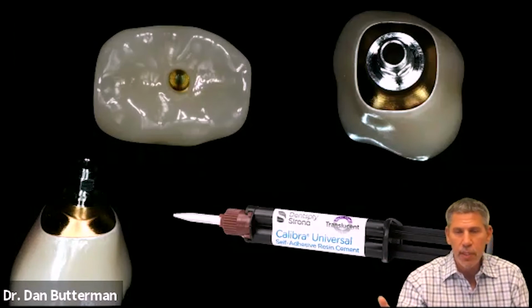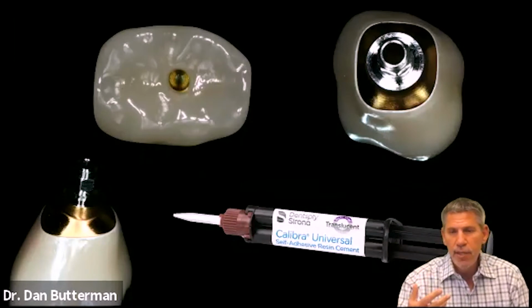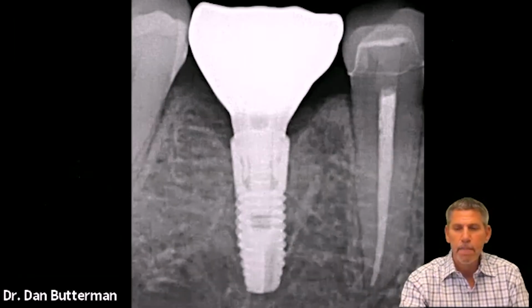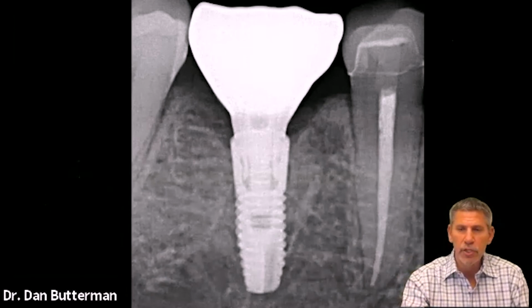If you get a screw retained restoration from your lab, they're doing this exact same process. They're just cementing the abutment to the crown extraorally and sending it to you. If you're manufacturing it with Atlantis, then yes, you would just do the same thing on your own, and then you have your final restoration.